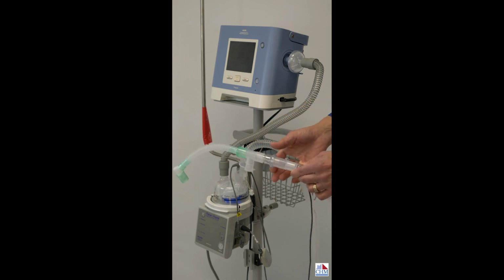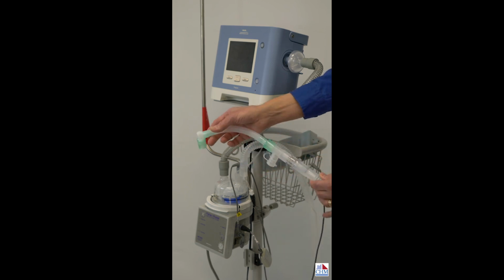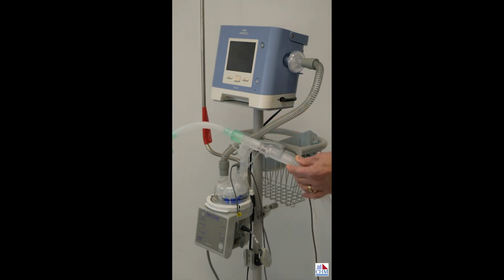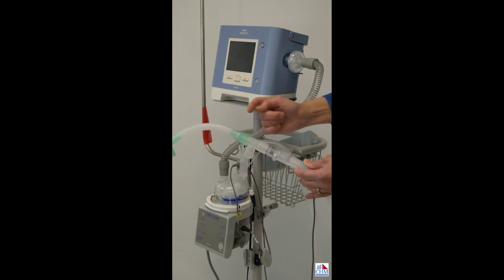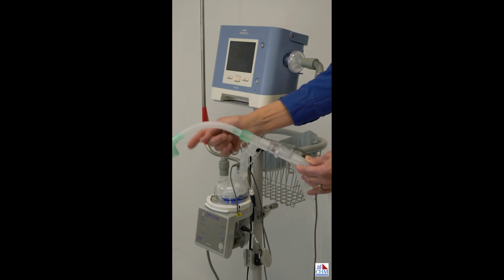You might wonder, why would I want a leak in a circuit when we're trying to ventilate somebody with positive pressure? The reason for the leak is to provide an escape for carbon dioxide. If you think about it, without the leak in here, if we were ventilating a patient hooked up to the trach, we would give the patient the airflow, and they would breathe that air back into the tube and then breathe that same air back in again.